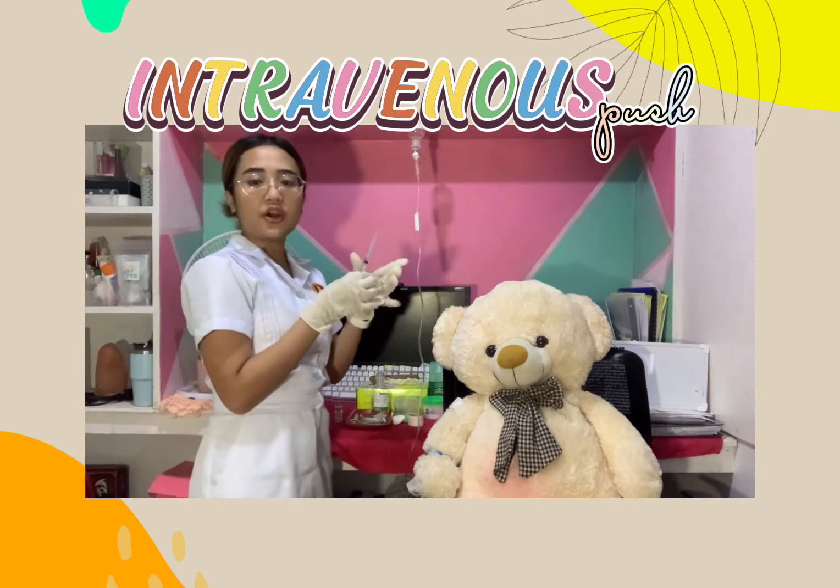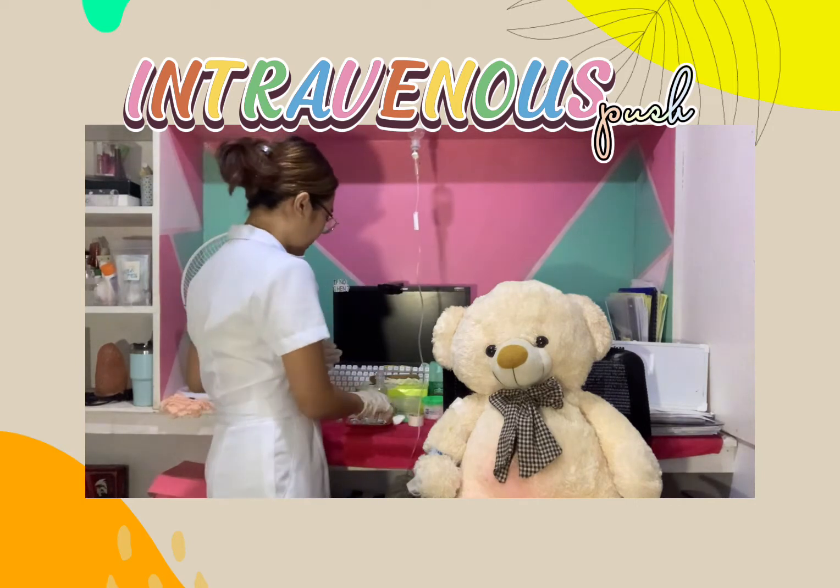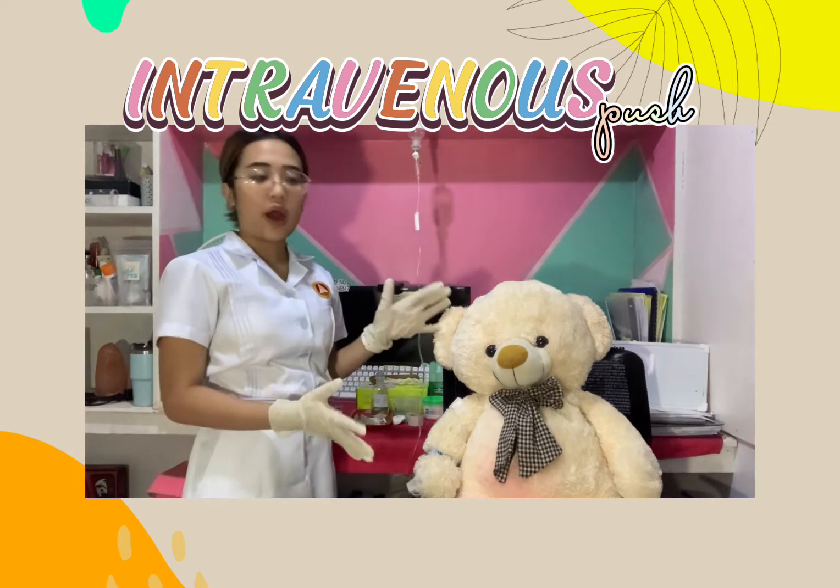And then when the ordered medication is already prepared, we will now prepare our patient.